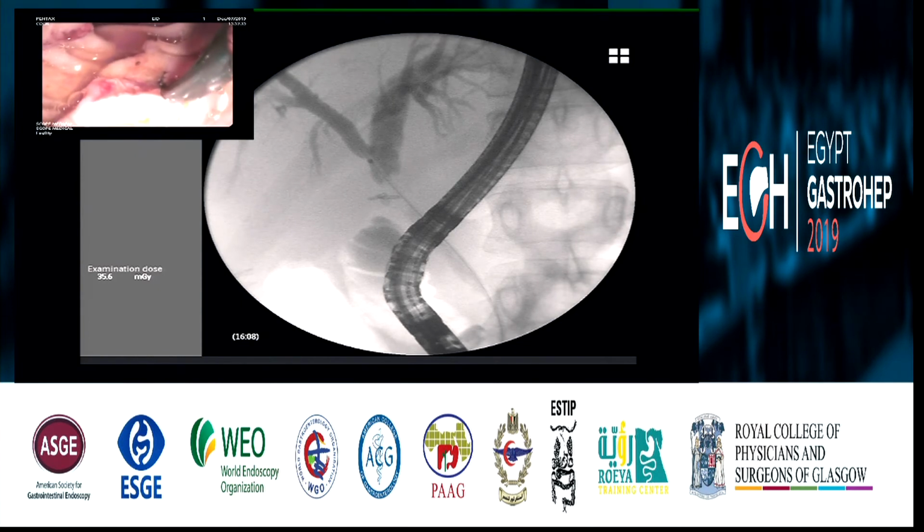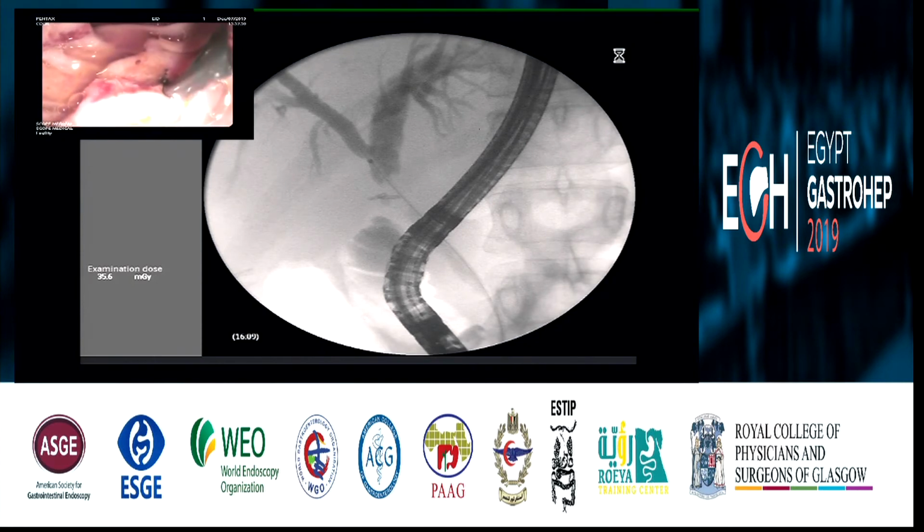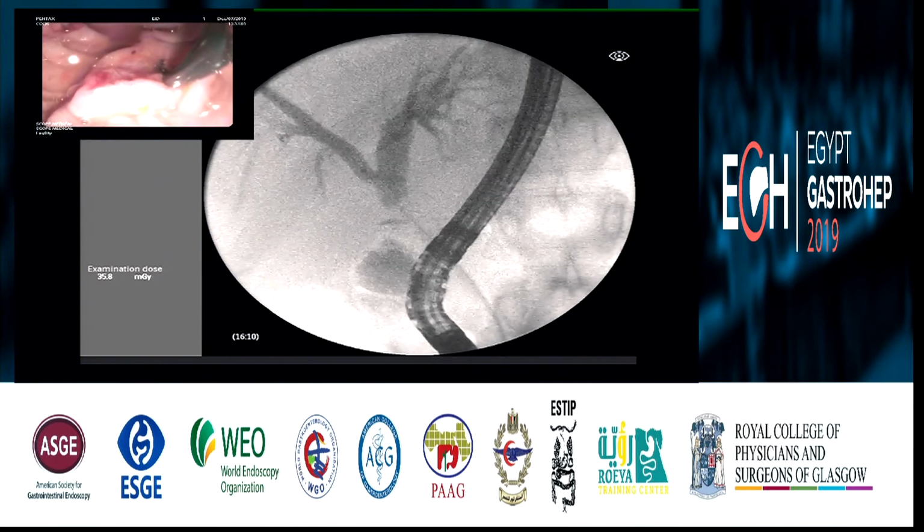Can we get the fluoro picture, please, not the endoscopy picture, to avoid perforation of the bile duct, because there are clips there. I don't know if something is missing from the intrahepatic biliary tree, like the right posterior duct, but we really injected a lot of contrast, and we could not see anything.